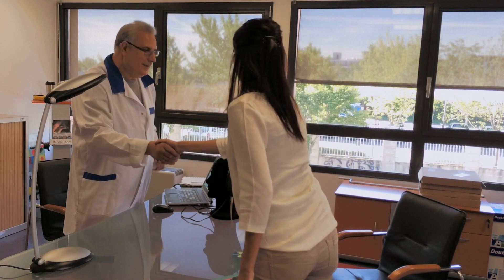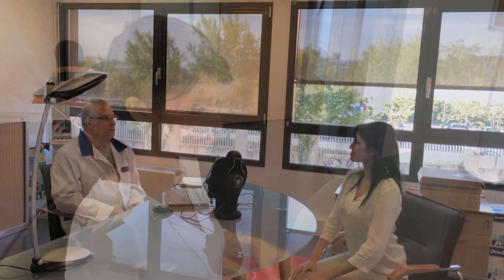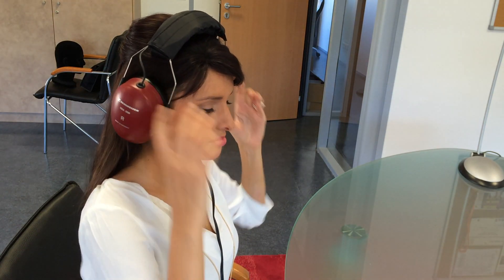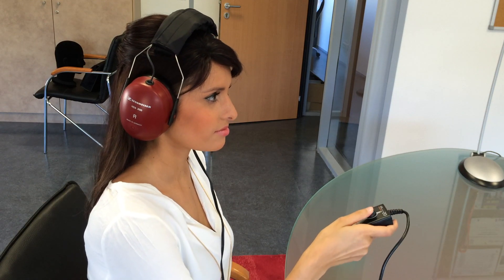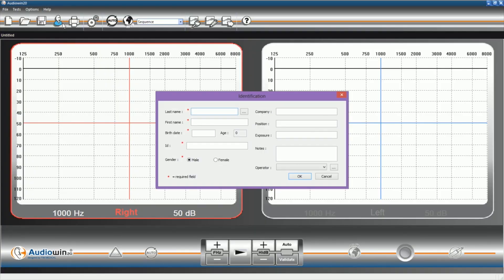We are now going to go through a complete test procedure. Firstly, the patient adjusts the headset comfortably. For identification, run the Audiowin20 software as shown. Create a new file and enter all the required information. Click on validate. You are now ready to perform a test.